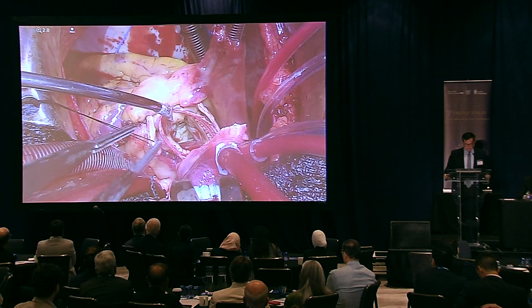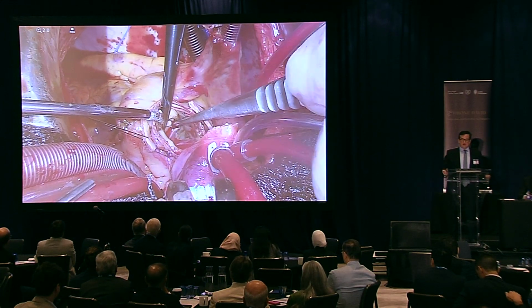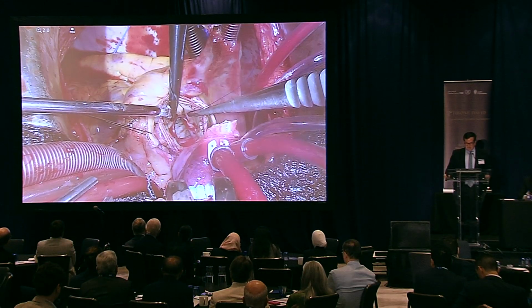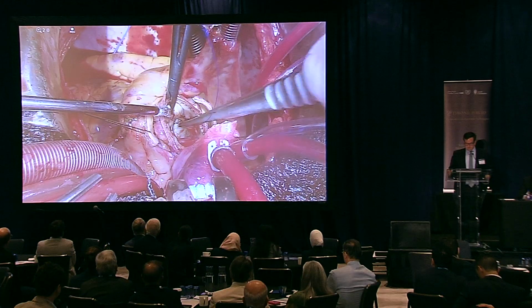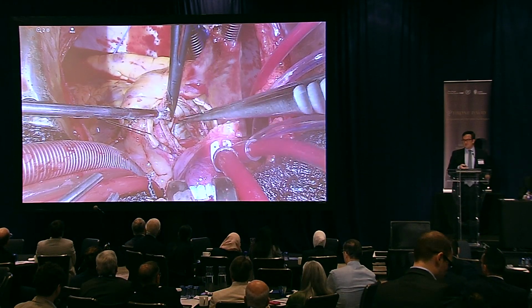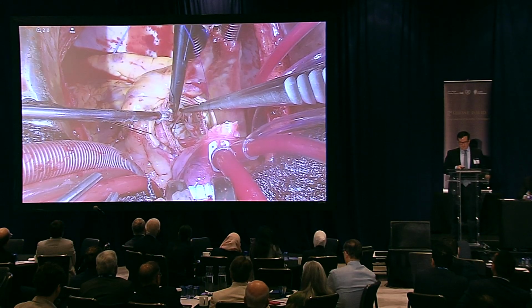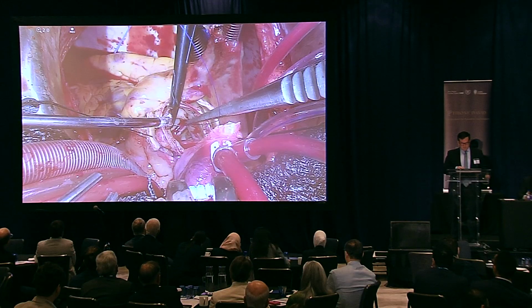So we're back in, we reclamped, and we're going to perform the same thing. Again, you'll notice that it's the right commissure, it's the right cusp again, and it's the same situation. You're not really able, oh, you know what, I think it jumped ahead. Well, for time's sake, we did a commissuroplasty and a central plication of the cusp. We took the clamp back off. I'll make a point of showing that.